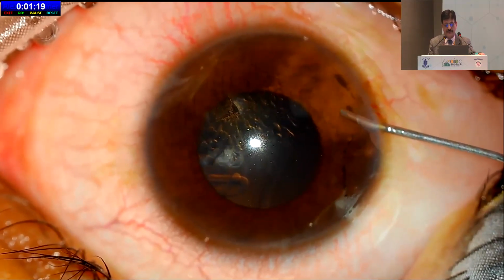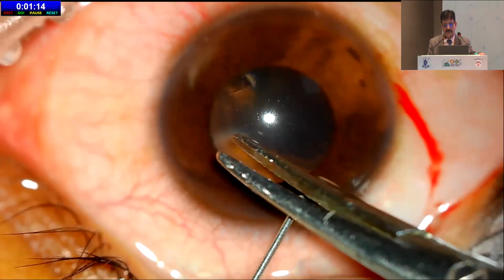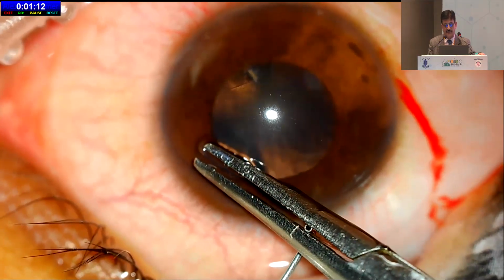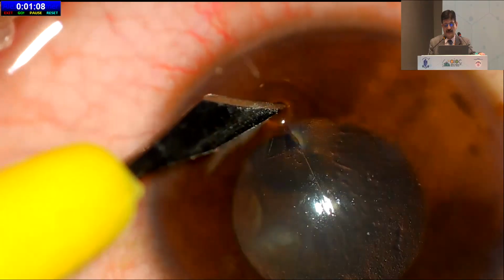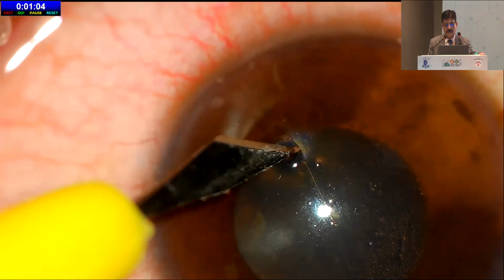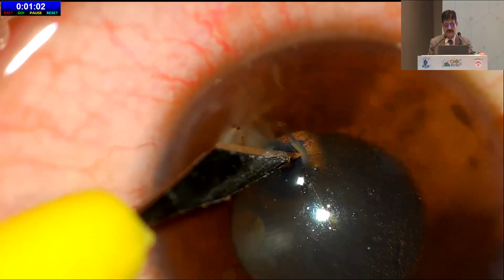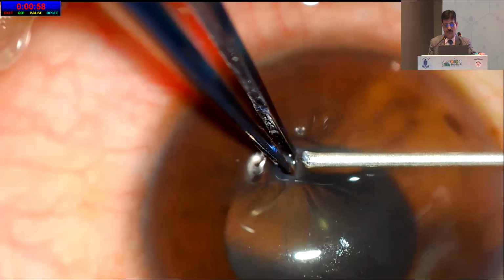So after filling the anterior chamber, now we had also become wiser that we will not use something like an iris repositor that is a broad end and it does touch the larger area of the corneal endothelium. Although in that patient we didn't get any endothelial decompensation, the patient is still with us, and we bent the cannula and we tried to remove the foreign body.